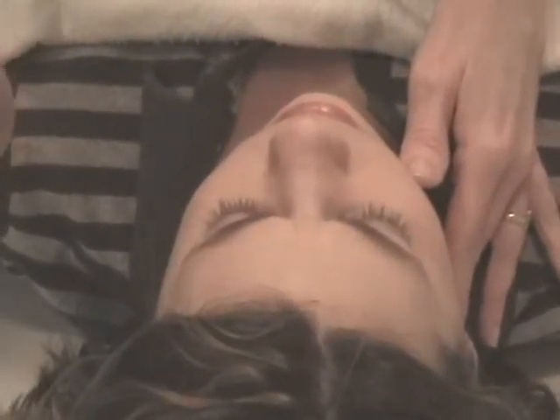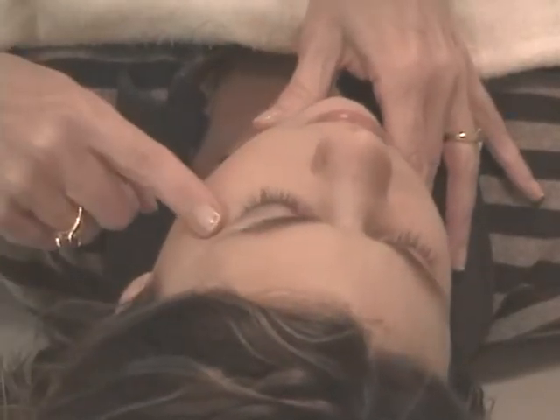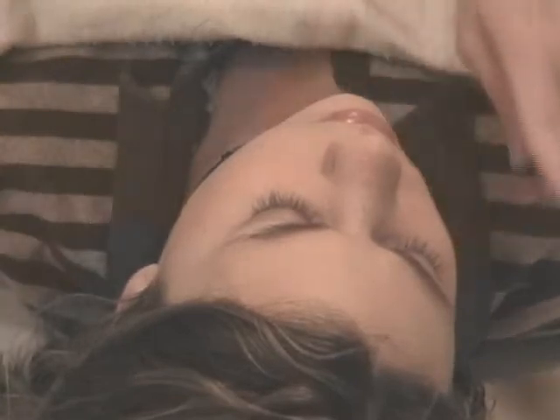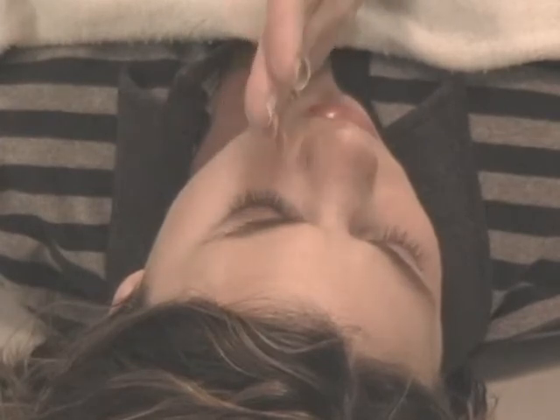I'm evaluating the MSP to make sure it's perpendicular. It's centered, first of all, then it must be straight up and down, must be perpendicular. I'm going to purposely offset her skull a little bit here. And I want you to look at the outer canthus of the eye out over the zygoma here. And you can see that there's a lot more width on her left side than on her right side. Okay? That would let me know that the MSP is not straight up and down, that the MSP is tilted. You do not want that. You want the MSP straight up.